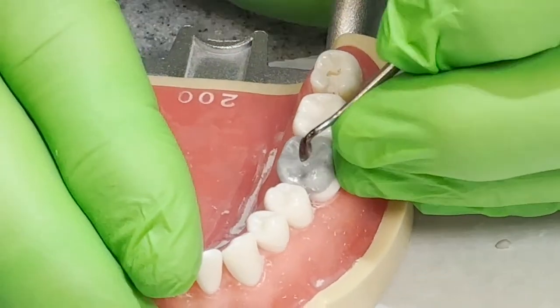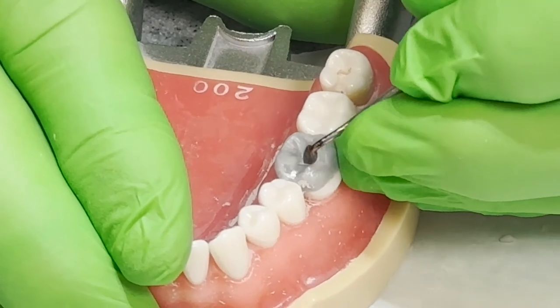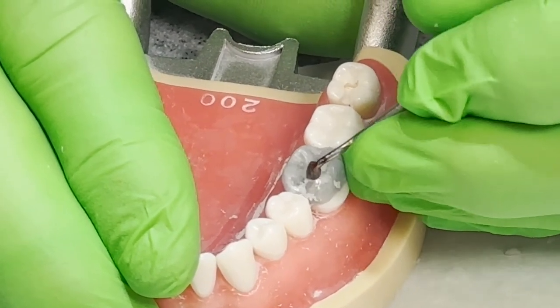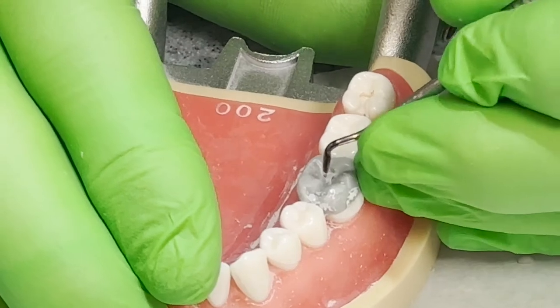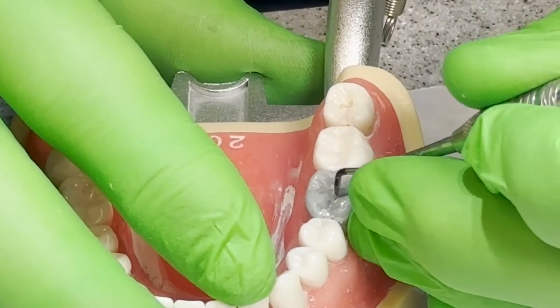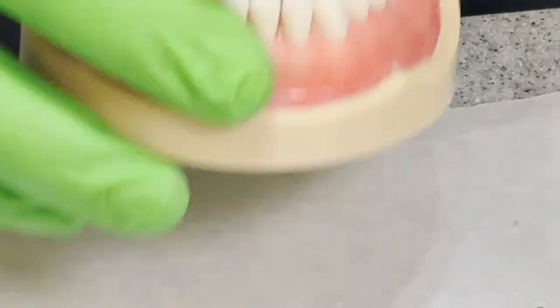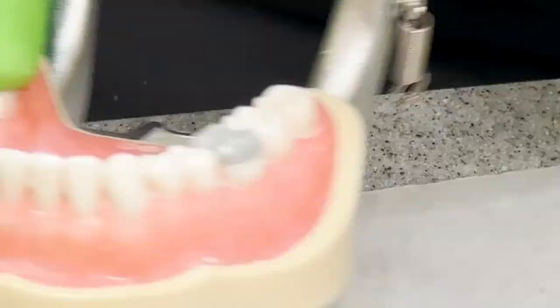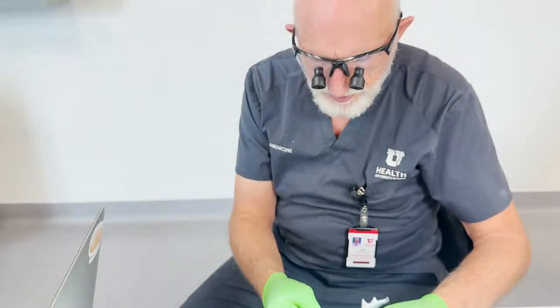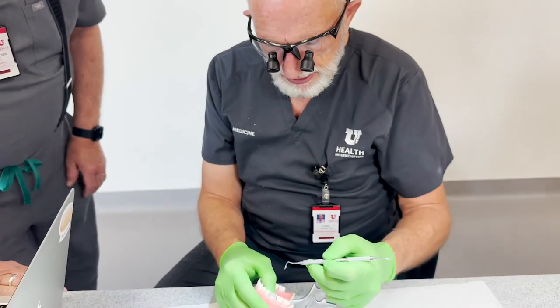Like it's a little thick. Okay. See if I can wash it off now and take a look at it. Are you going to polish it a little? Yes, then I'll polish it here a little bit.